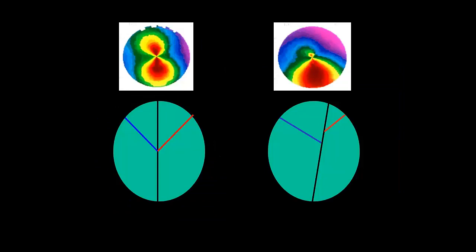If I show you these two maps, you would think they are extremely different. The upper left looks like a symmetric astigmatic eye. The one on the right looks like highly asymmetric inferior steepening that almost everyone would call keratoconic. And these two maps are produced from the identical shape. This is actually an astigmatic test object. The one on the left is 0 degrees angle kappa. The one on the right is 5 degrees, which is considered the upper limit of physiologic normal. So the exact same shape, but completely different curvature maps. And that's one of the problems with curvature.